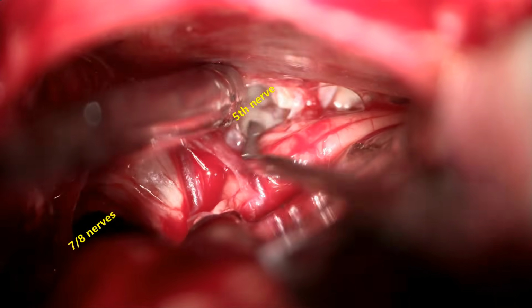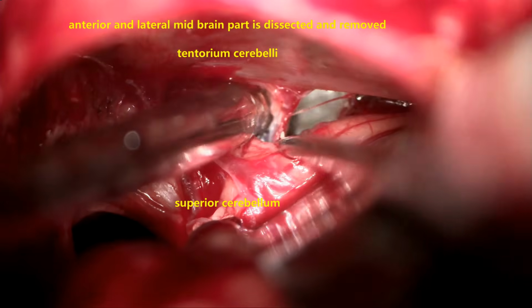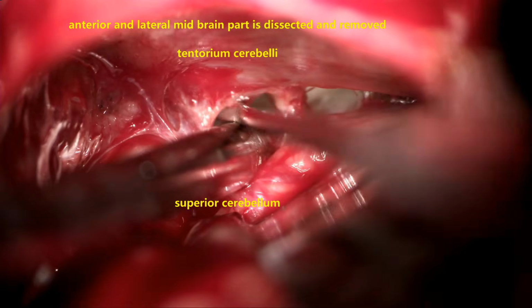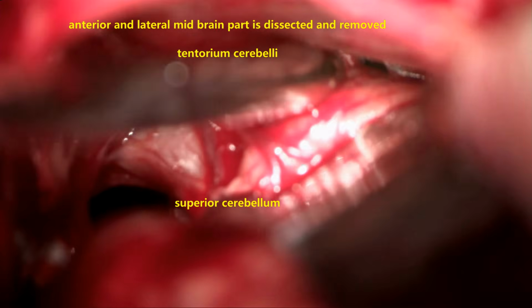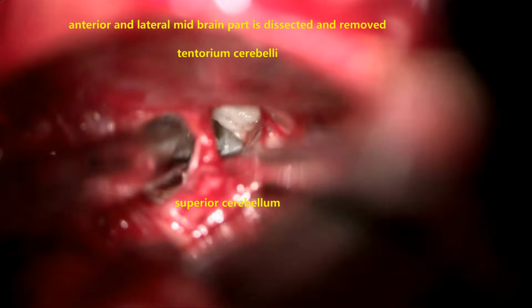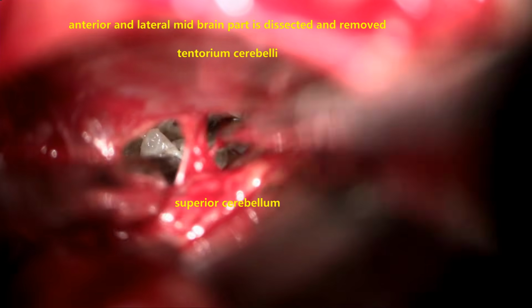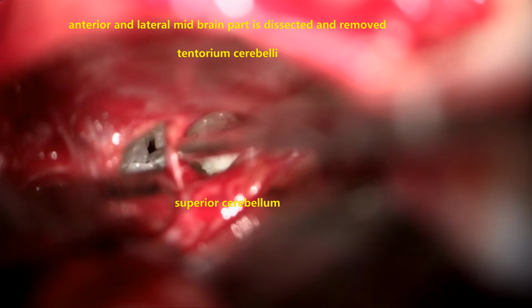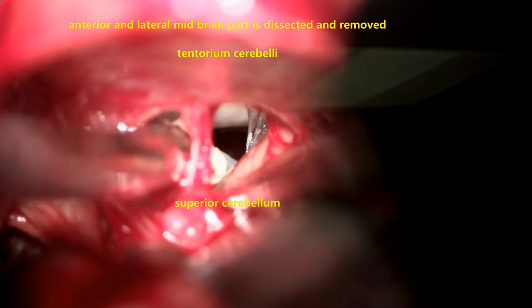Now, once we debulked and took off the inferior part at the level of the 5th nerve and the 7th, 8th complexes, now we are going superior to the trigeminal nerve, just below the tentorium, on the side of the midbrain and anterior to the midbrain. The arachnoid is open, in the subtentorial region, and the epidermoid inside the arachnoidal plane is started debulking.